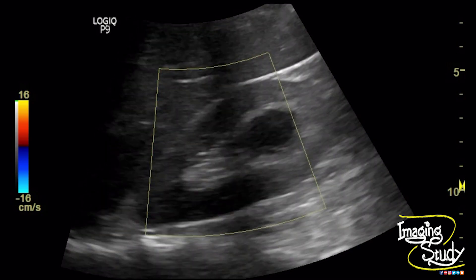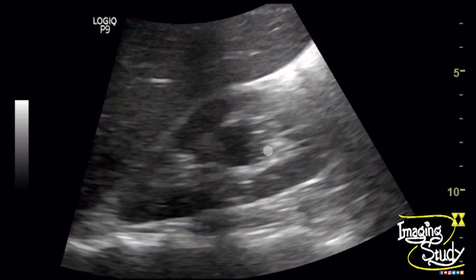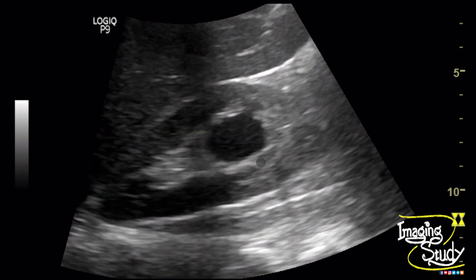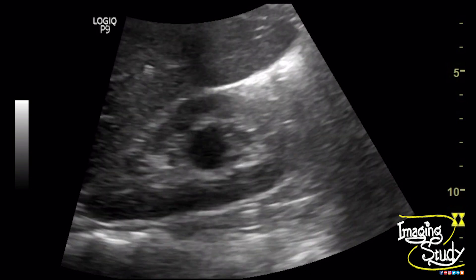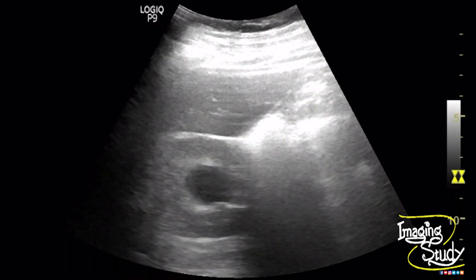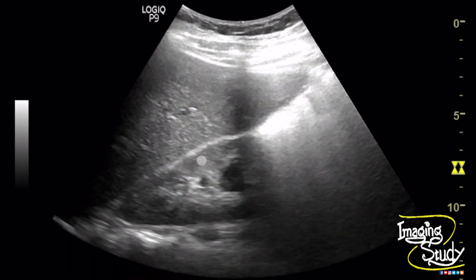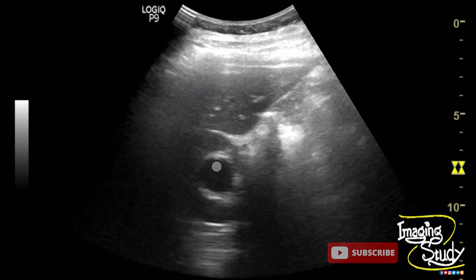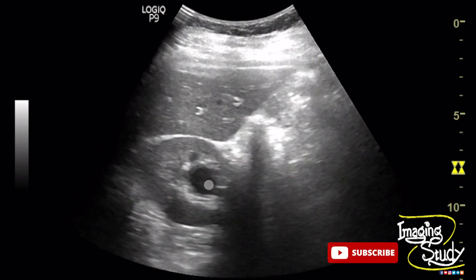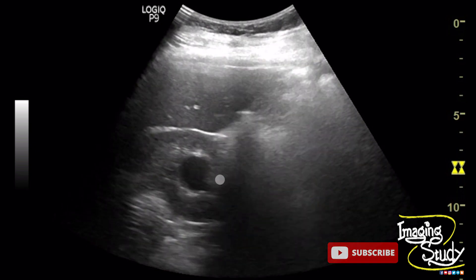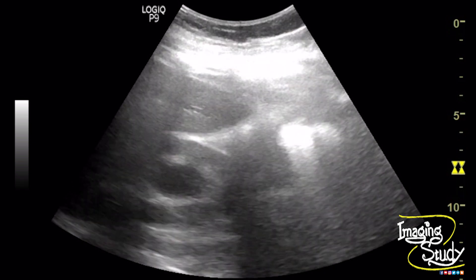You can also see some posterior acoustic enhancement, but due to sinus fat it may not be well appreciable. This cyst has no extension up to the renal cortex — it is confined within the pelvic region, indicating a parapelvic cyst. There is no internal septation or marginal calcification.